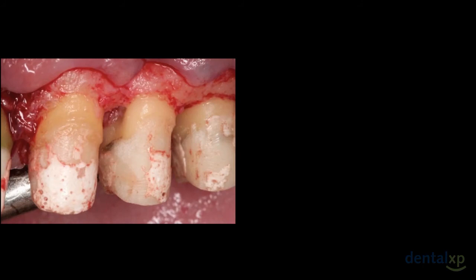Upon reflection of the tissue and looking at the arrow location, we are looking at a concavity on an upper first bicuspid, tooth number 12. You can clearly see the calculus coronal to that just under the CEJ. And again, that's why we remove CEJs. It's another rough area that accumulates plaque and calculus.